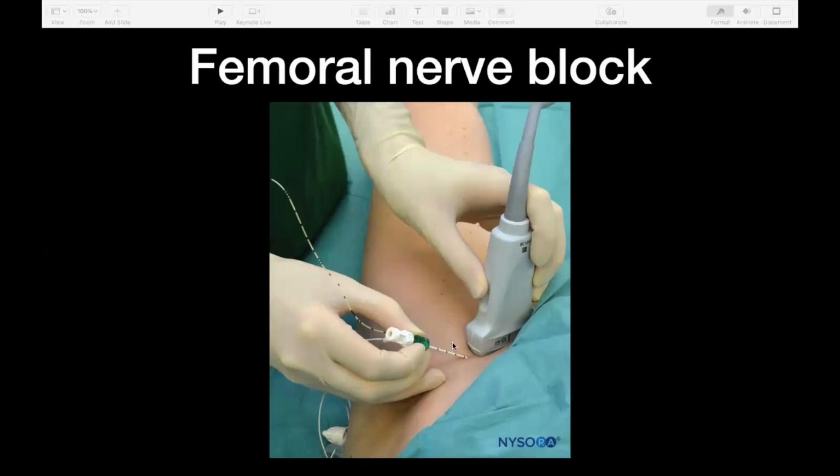So ideally everything in a straight line with you over here, probably a bit further around this way compared to where this person is standing over here, needle, ultrasound probe, and machine over here. So everything's in a nice ergonomic position.